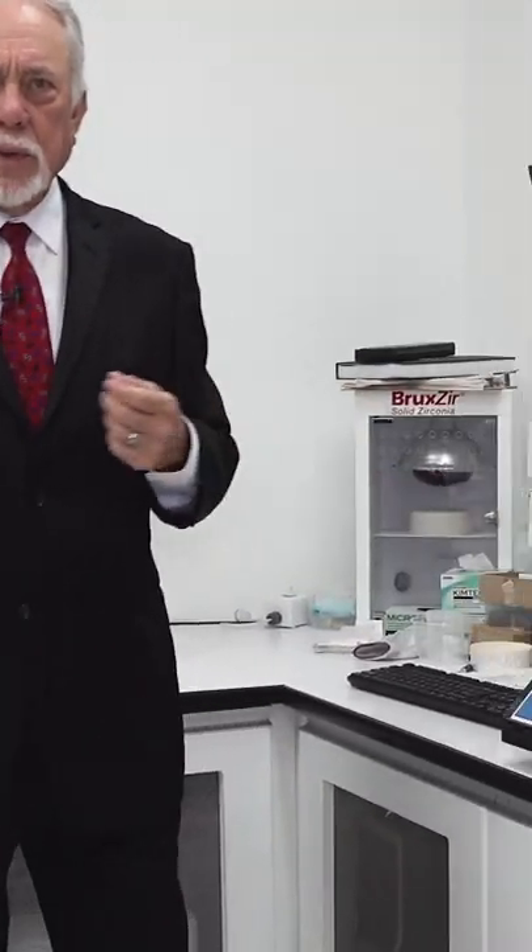I'm standing right now in front of part of the research and development operation, and just some simple tools that we use here over the years. One of them would be this Instron machine.